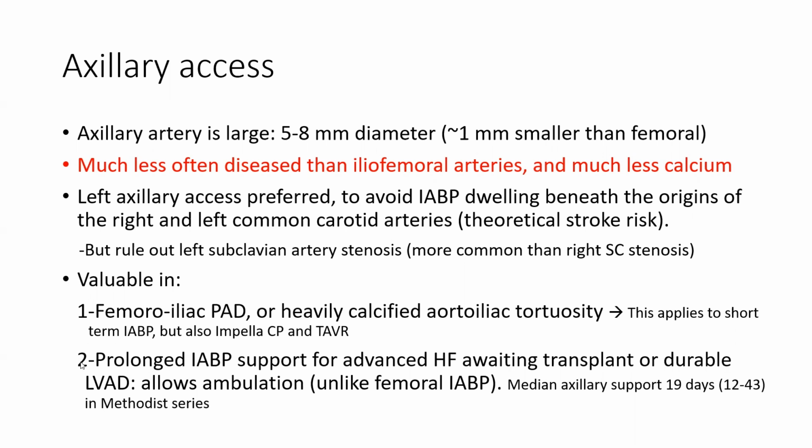A second instance where it's valuable is prolonged balloon pump support for advanced heart failure awaiting transplant or durable LVAD. Axillary balloon pump, as opposed to femoral balloon pump, allows ambulation. And there are multiple published series about using axillary balloon pump in patients awaiting transplant. The median axillary support used in those studies was 19 days in the Methodist series and 17 days in the Chicago series, and it's up to 40 days. Typically, when I say prolonged balloon pump support, I mean more than 5 to 7 days.